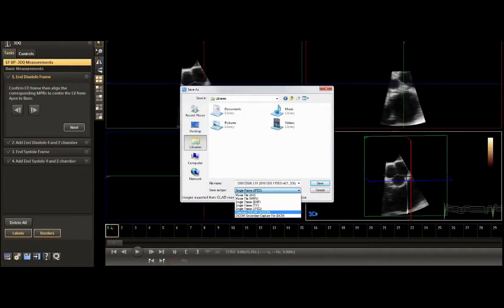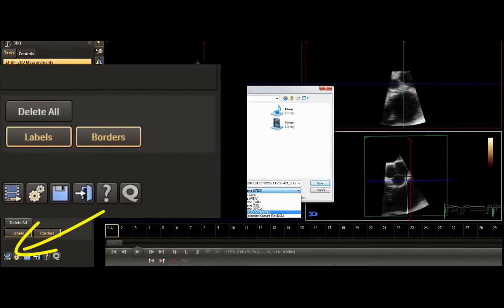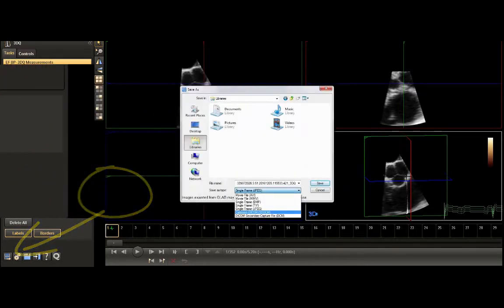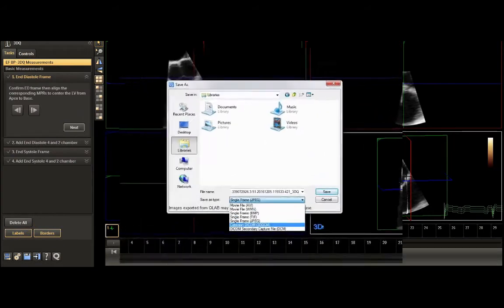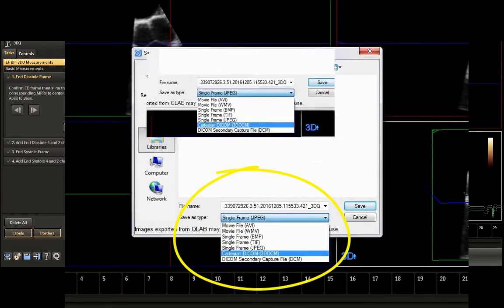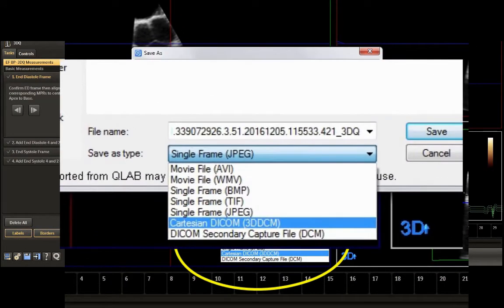This brings you to the 3D Queue home page. At the bottom left corner of the screen, select the Filmstrip symbol that allows you to save the data. Under Data Type, select Cartesian DICOM. You should end up with a file size in the order of 100MB and above.